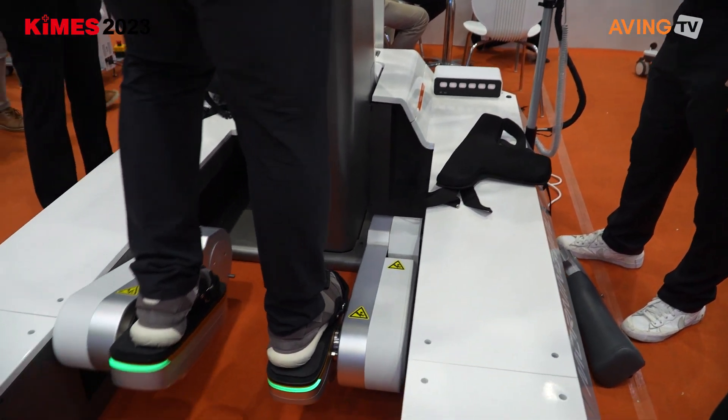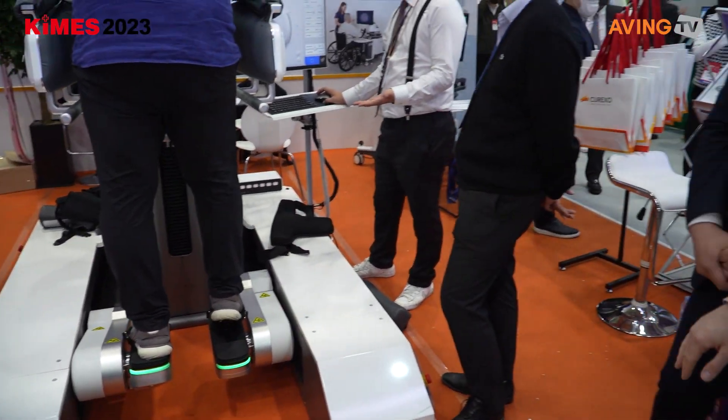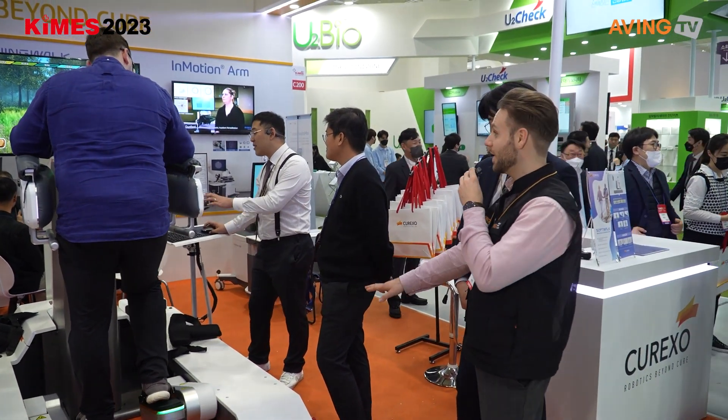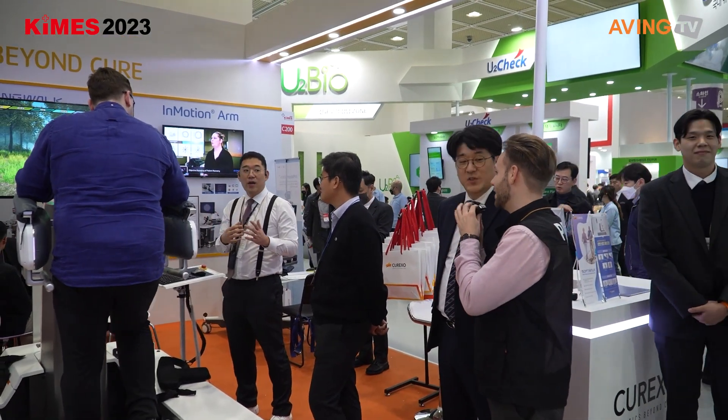As you can see, the feet are attached to the pedals there, and the robot is mimicking the movements of the patient, so it's helping the patient walk right now. As you can see, we can see a screen there as well.